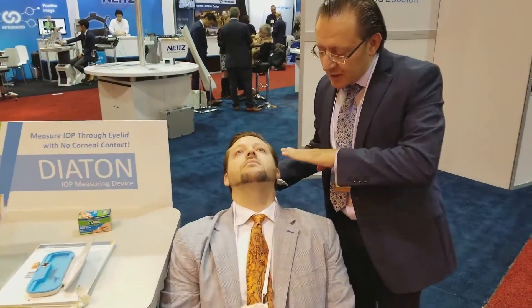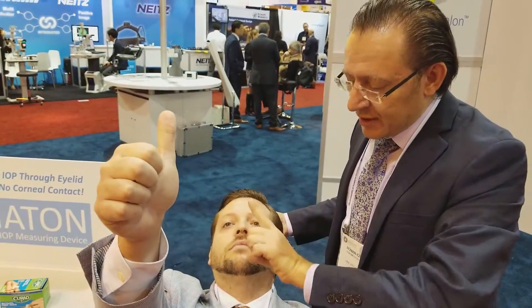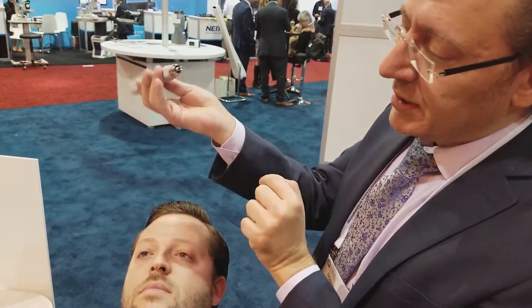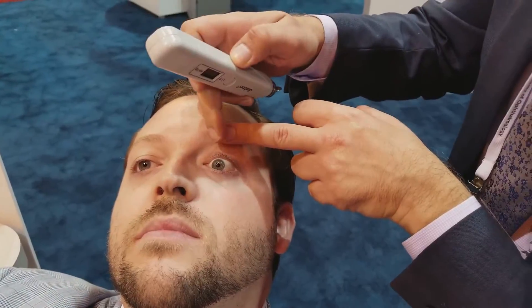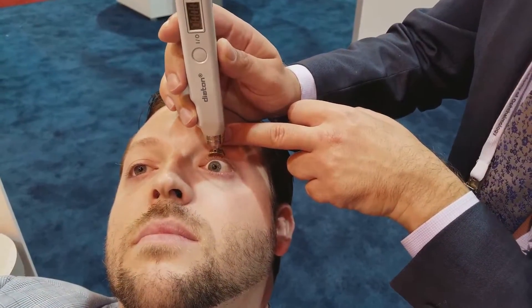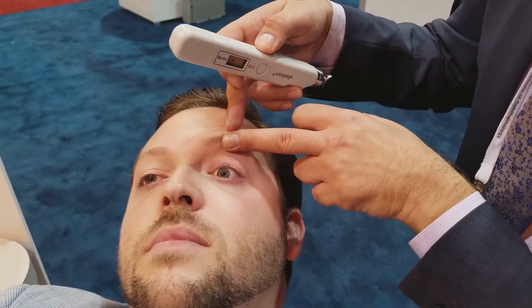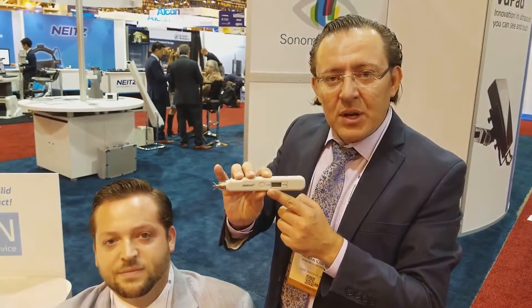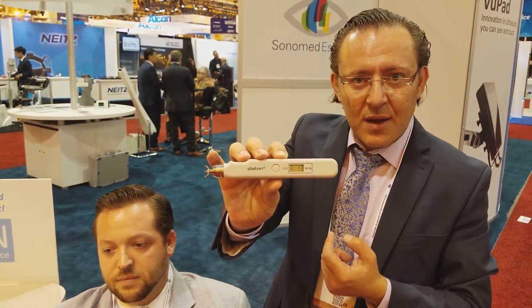Tilt the head back as horizontal as possible. Ask the patient to extend their finger forward as a pointer to center on the patient's eye. Hold the device with three fingers on one side and thumb on the other. Turn the device on, tilt it back, and use the edge of your palm for support on the patient's forehead. Gently pull on the eyelid so the edge of the lid is above the edge of the limbus — you want one millimeter of sclera visible. Position the tip right over the tarsus overlaying it against the sclera and take the first reading. Hold the lid steady, then take two more readings. Press the center button to get the average. We averaged 13 on the display.